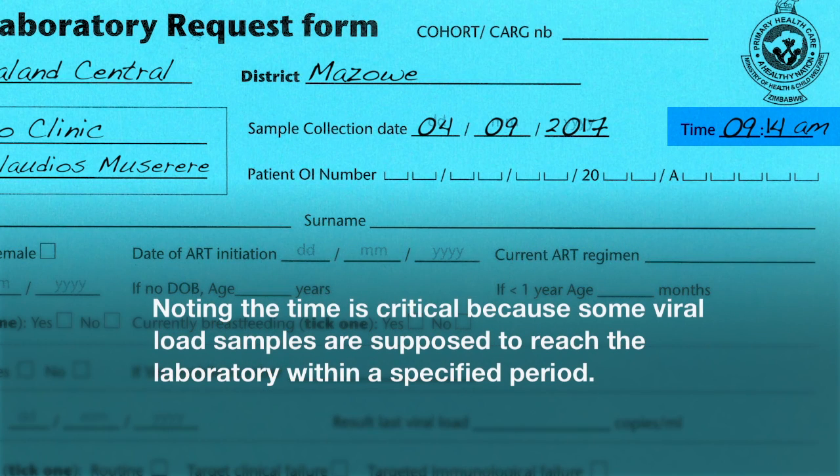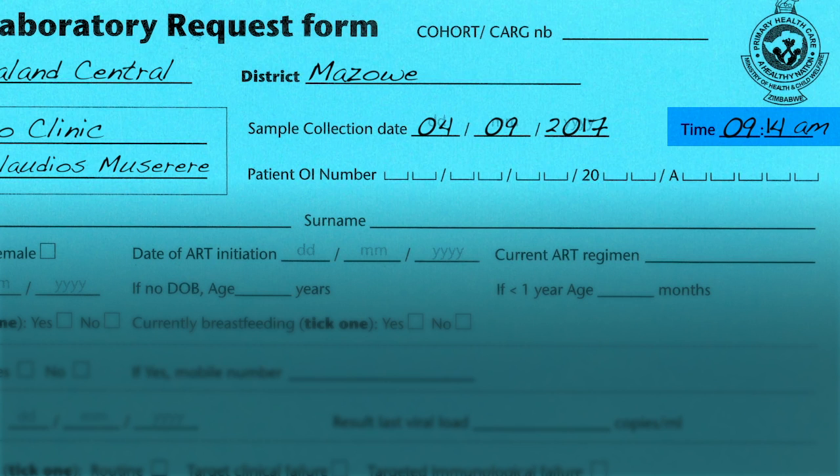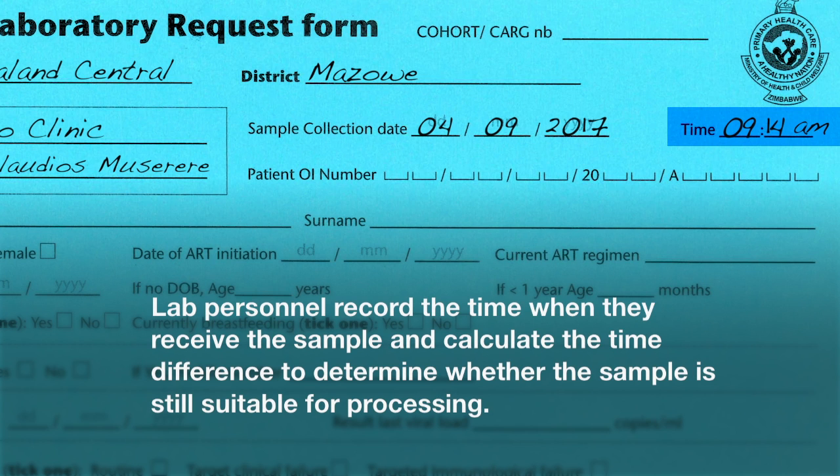Noting the time is critical because some viral load samples are supposed to reach the laboratory within a specified period. Lab personnel record the time when they receive the sample and calculate the time difference to determine whether the sample is still suitable for processing.